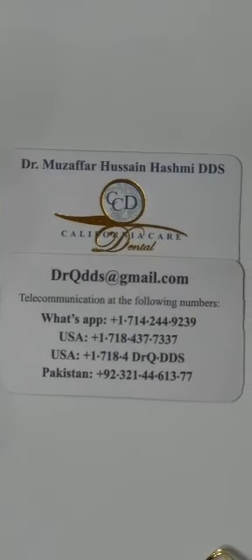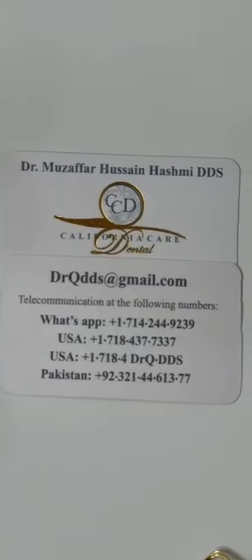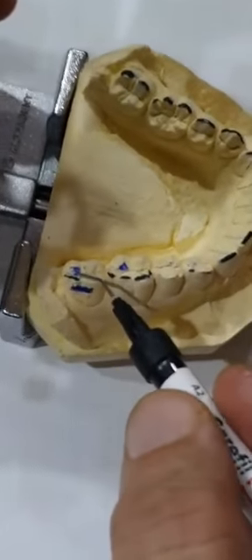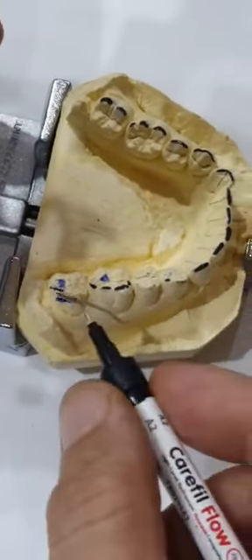The example we are using is a cast — this is a lower cast and that's the upper cast — and we got them both articulated. The idea is to show you here instead of in the mouth so you get a better idea. I'm going to normally use the lower teeth to build up the occlusion, and I normally start with the lower right side.